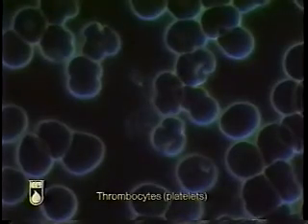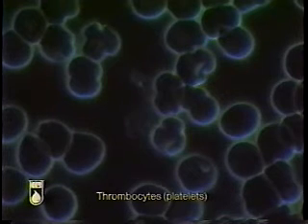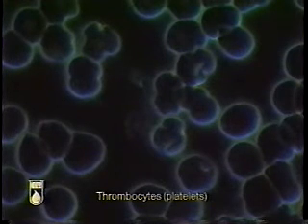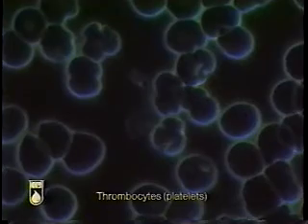And in this image, there are a pair of small thrombocytes or platelets which derive from megakaryocytic tissue. We note that these cells are extremely essential in the clotting process and in the maintenance of cellular homeostasis in the blood.